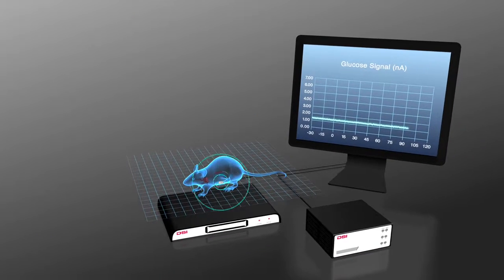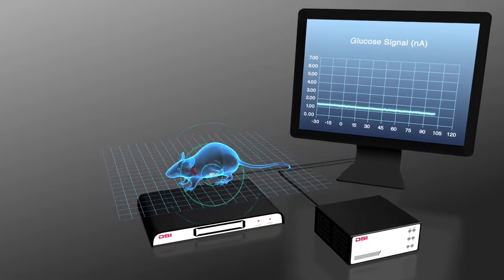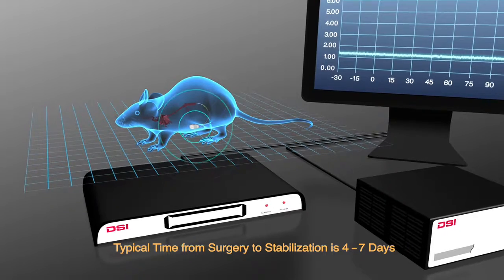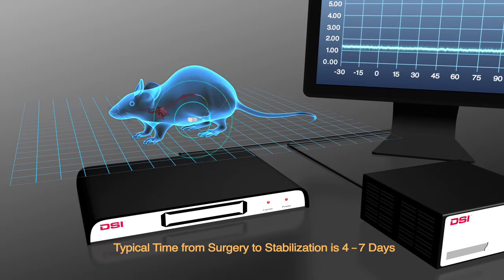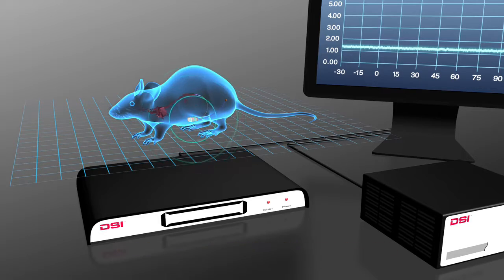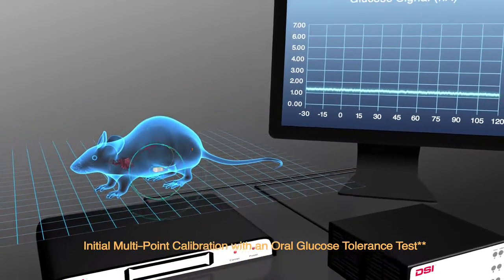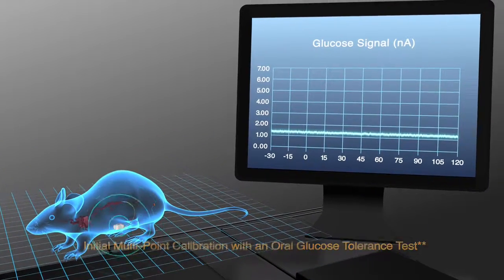After surgical implantation of the XG, place the animal in range of a receiver, leave the implant on, and enable data acquisition to assess the animal's health and observe stabilization of the implanted sensor. Once the sensor has stabilized, the initial multi-point calibration can take place.